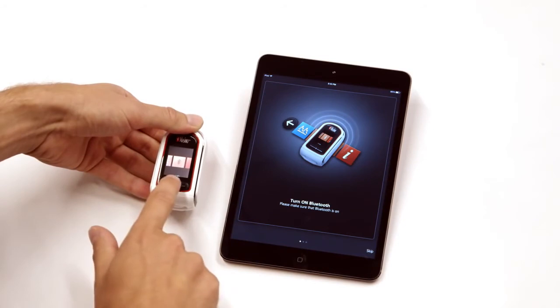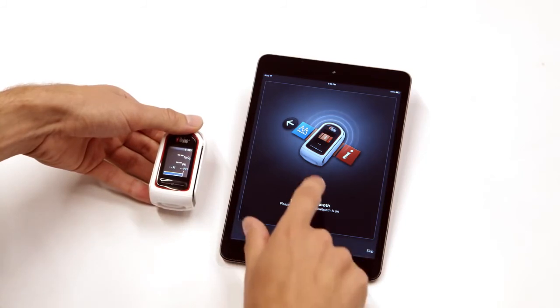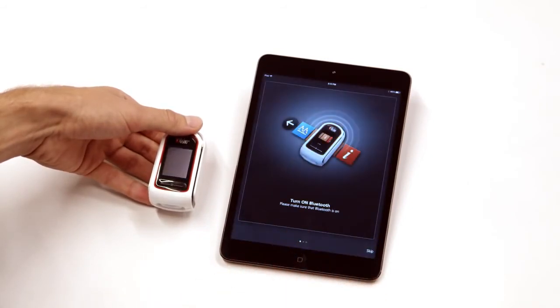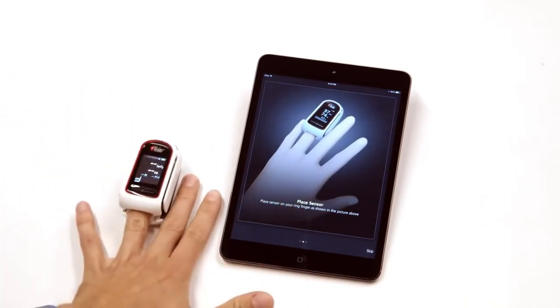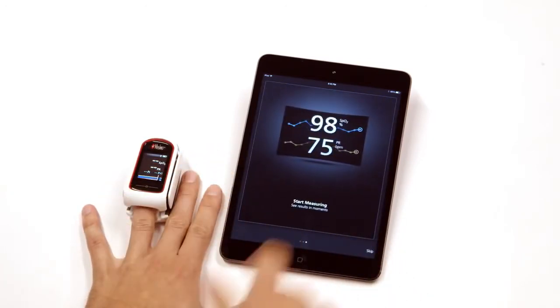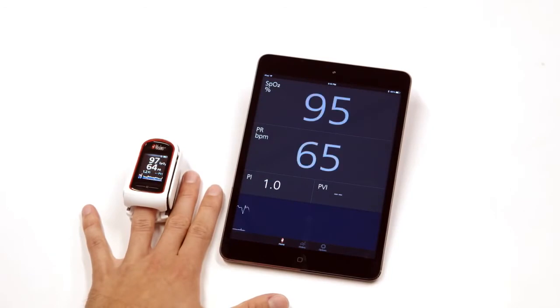Turn on Bluetooth on your MightySatRx pulse oximeter. Ensure Bluetooth is enabled on the smart device, following the app instructions as shown on your smart device. Once MightySatRx is connected to a smart device, confirm that the readings on the MightySatRx and on the Masimo Professional Health app are synchronized without a delay greater than 10 seconds.